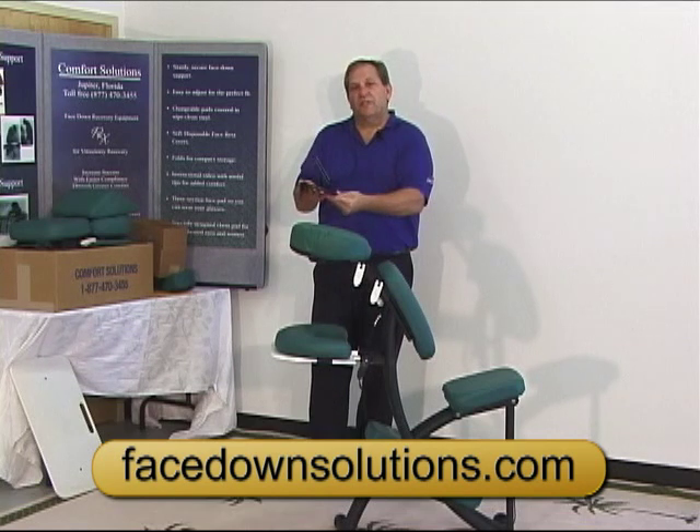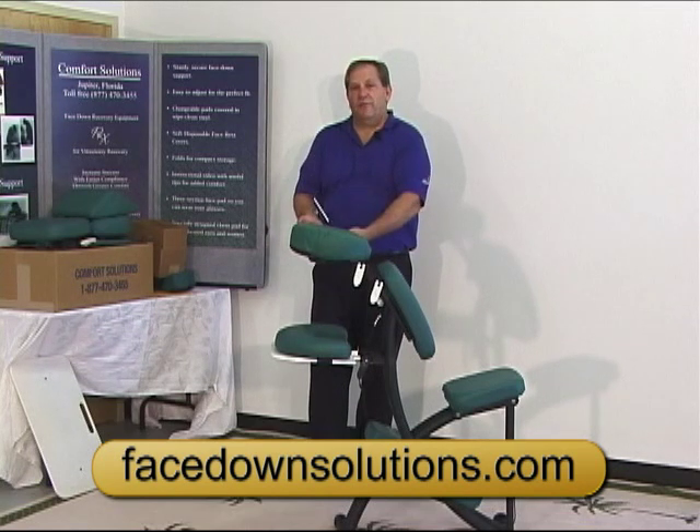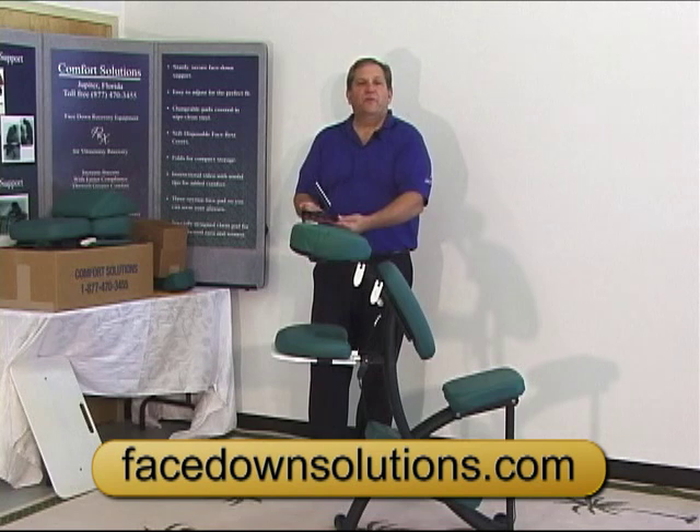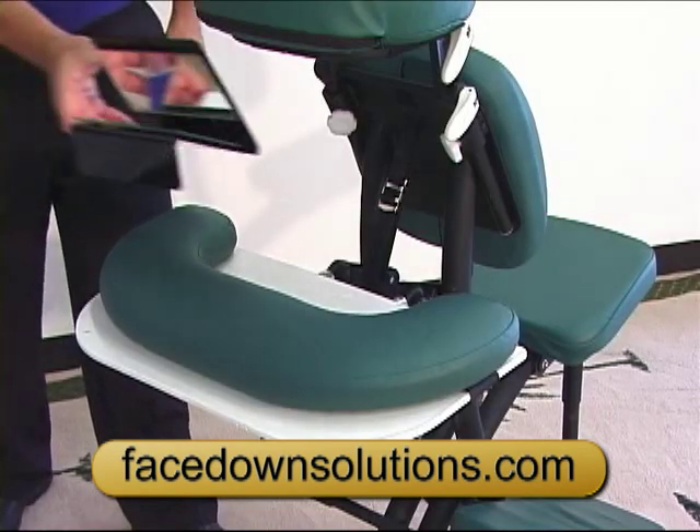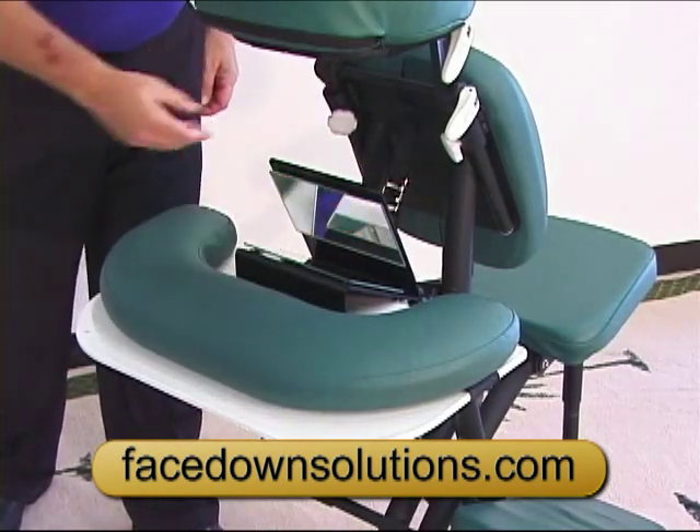What you need to do to adjust the height is adjust the tray table up or down, or place books under it to get it to the height where you need it. It's something that you're going to have to play with, but you're going to find that it's the most valuable thing that you have. It just sits right on there like that.